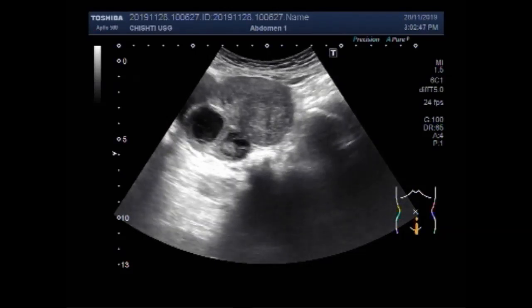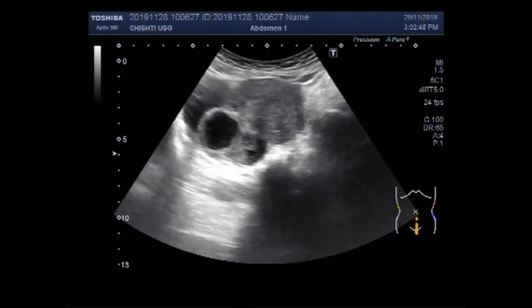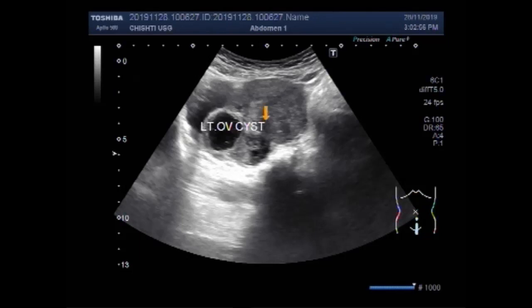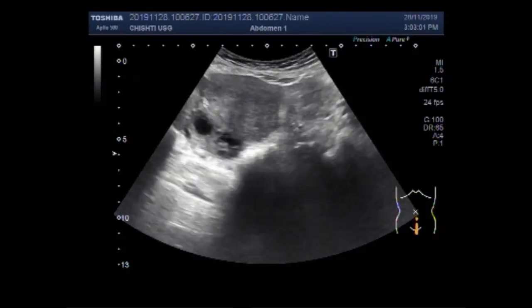Now you are going to see the ovarian cyst and the fibroid in the uterus. This is the left ovary, and this one is the mass — fibroid.